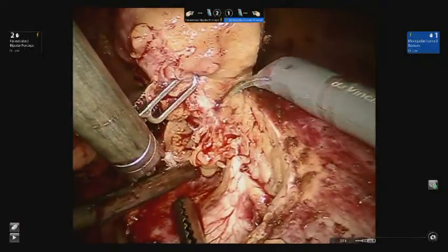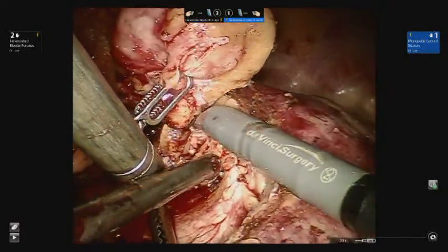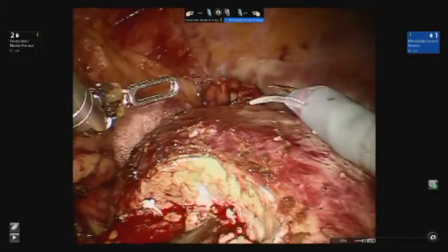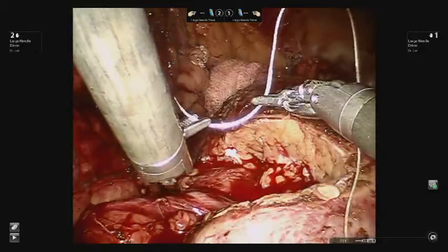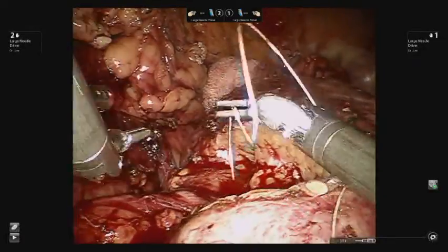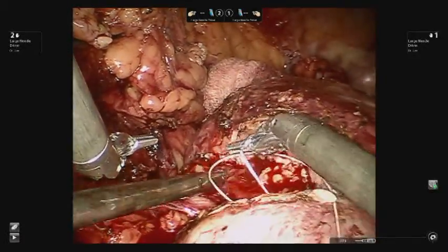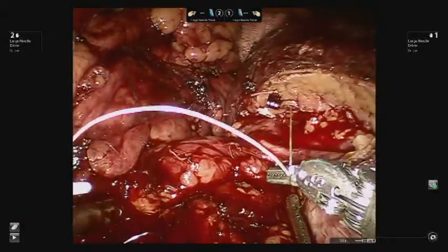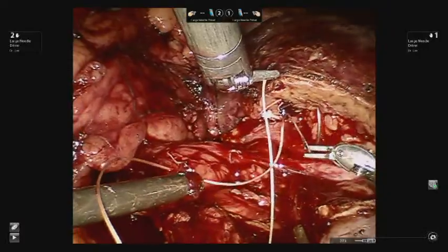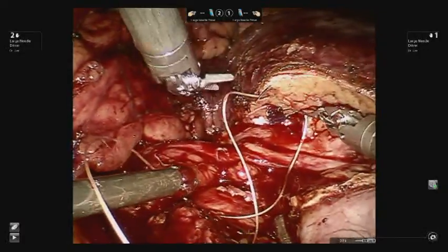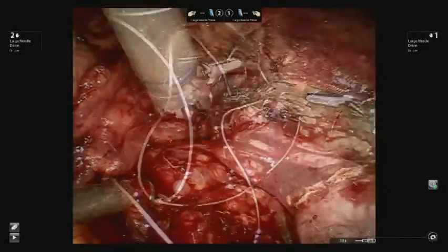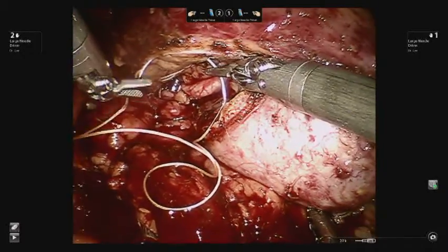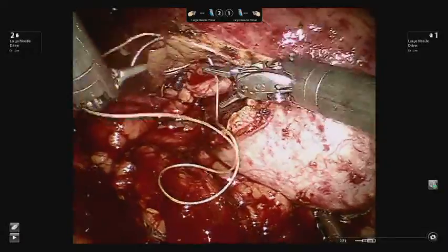Segmental arterial branches encountered during the resection are clipped with Hem-o-lok clips. A running 2-0 Vicryl with a lapar-tie on the end is used to close the collecting system and achieve hemostasis. In the case of the hilar tumor, it is important to be careful not to suture too deeply, which could incorporate and potentially constrict the renal pelvis.